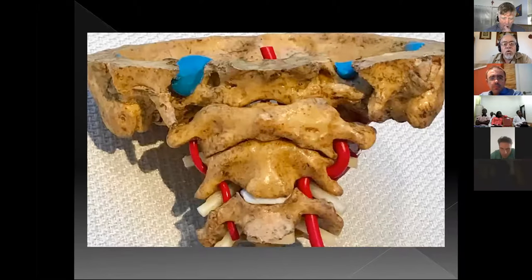I'm going to go to the anterior slide. So as you can see in this part, you can have at least 1 centimeter to the right and 1 centimeter to the left, and remove the anterior part of C1.